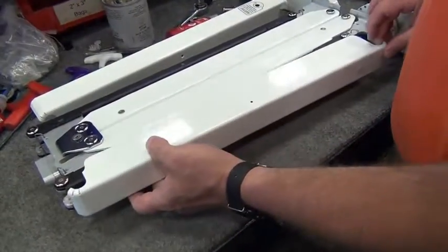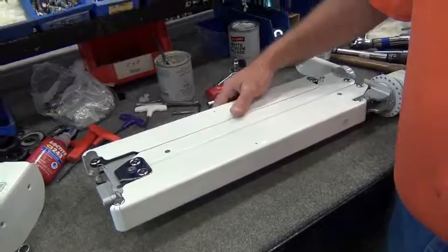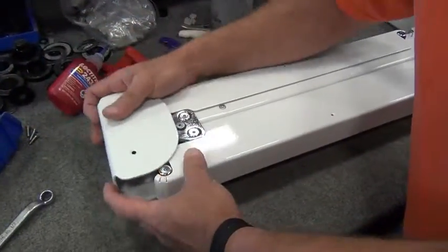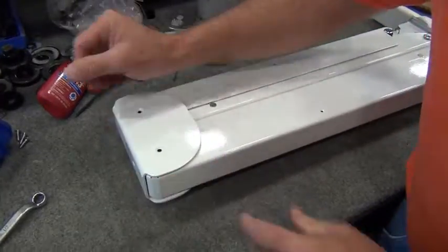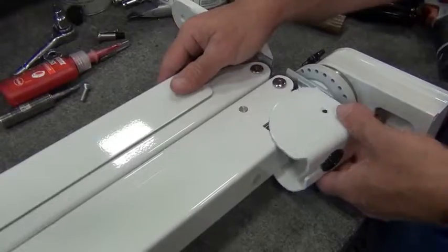Attach the arm cover with the hole plug on the bottom of the arm close to the wall ear. Attach center covers first, then end covers. Use 10-24 by 3/4 inch panhead socket cap stainless steel screws and 6-32 by 1/4 inch panhead socket cap stainless steel screws.